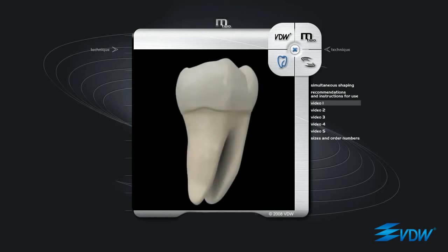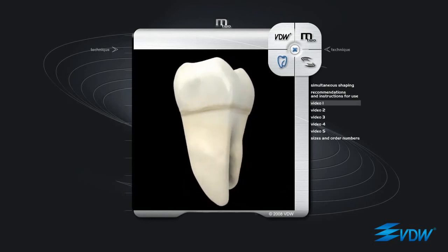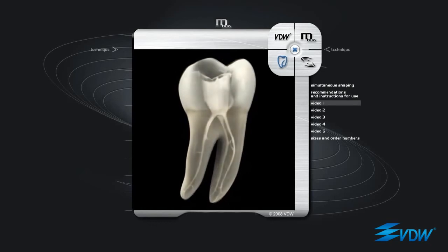Before commencing preparation with M2 instruments, patency of the root canal should be checked with hand instruments in ISO sizes 8 and 10. The first instrument to be used is M2 ISO 10, taper 04. It is inserted into the entrance of the root canal and rotation is started. Contact with the root canal walls makes the instrument progress naturally in increments of 1 mm. In narrow or strongly curved canals, progression can be slowed down to prevent stressing the instrument. In this case, passive filing is recommended before continuing with natural incremental progression.